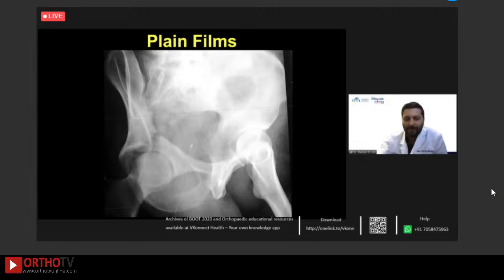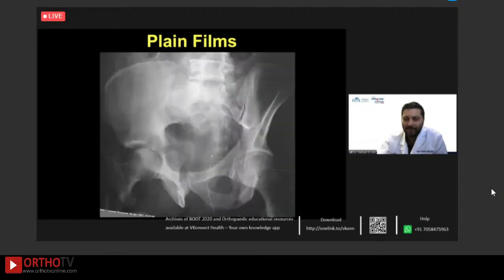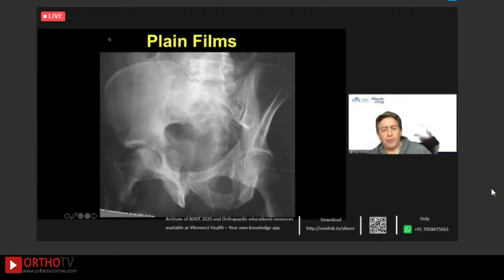There's one on a few different views. There's a free piece that I can't quite figure out where exactly that is. So that piece, I would want to study the CT more to see how big that is, if that's something I'm going to go after. You mean this here, Hassan? Yeah. That's actually just part of the roof that's attached. So it's not a separate fragment. It's not. I'll just tell you, it's not a separate fragment.